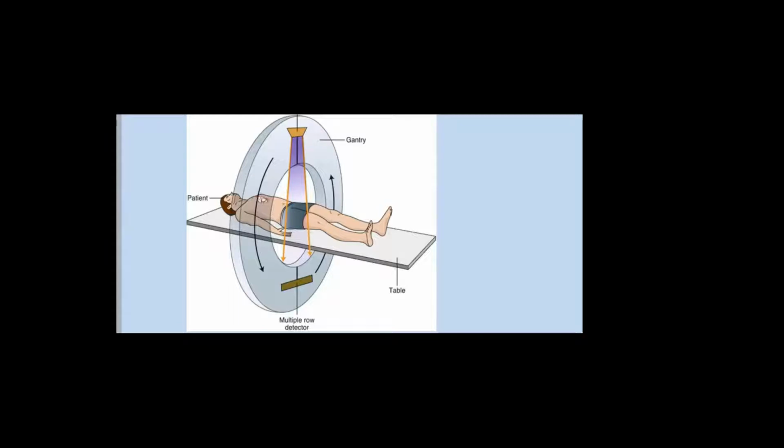Abdominal organs are not moving, the brain is not moving, but the heart is moving. That's why the technology took time to equip the machine and hardware with the ability to enhance the temporal resolution so as to scan the heart.